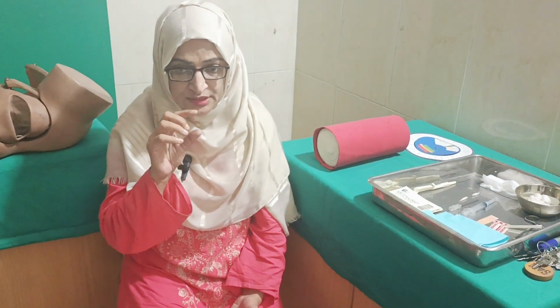When you are sure the patient is properly counseled, then you have to confirm or rule out pregnancy by asking her LMP. After this, you have to be very careful. When you have removed the package, you have to place this Implanon in an upright position, so the rod remains inside the cannula. So these are the prerequisites. I have already told you about the contraindications and complications. Now I will move towards how to insert this Implanon or the Jadelle.